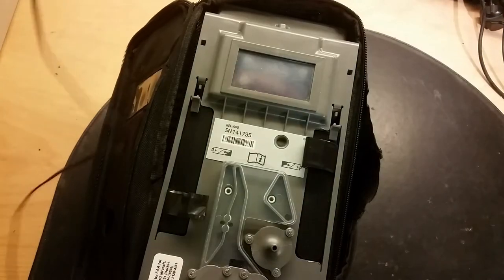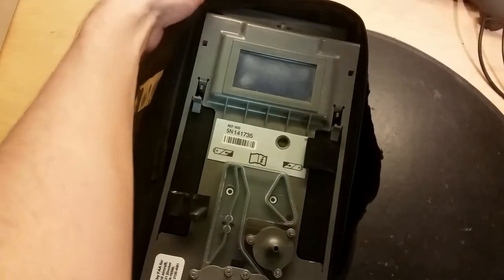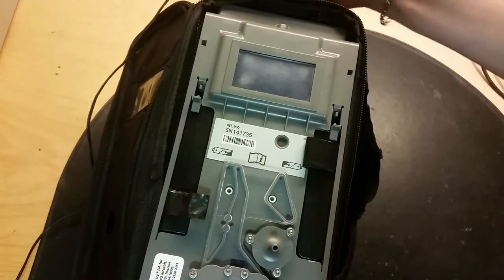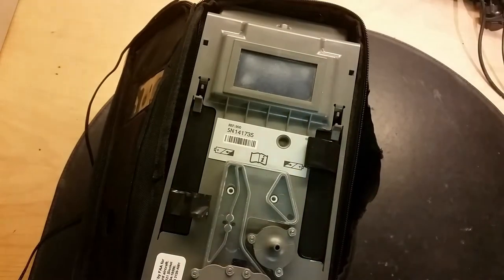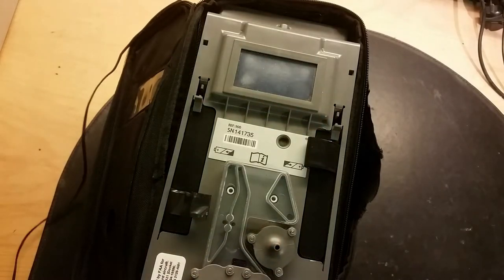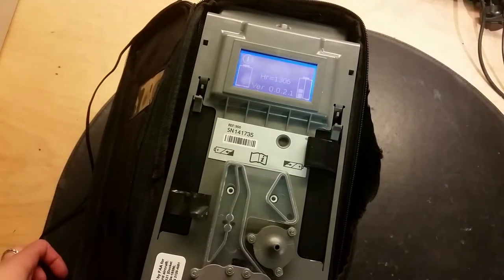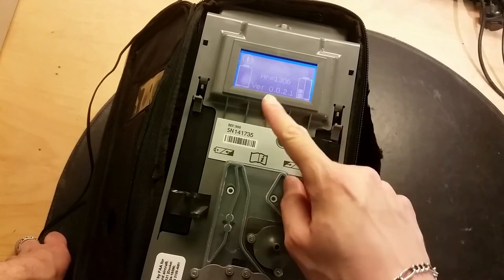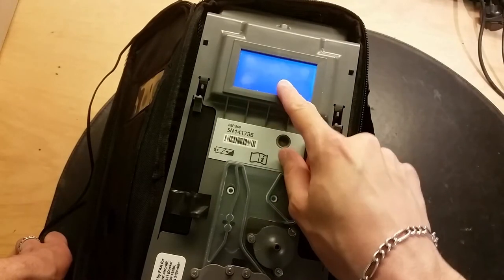Let's plug it in and see if it does anything - just a normal connector on the back. We'll connect 24 volts to it. It doesn't like 24 volts but it works. Here you can see the run hours are 1300 and it's shut off.